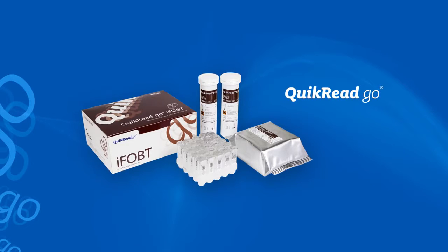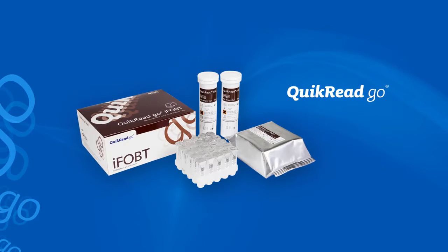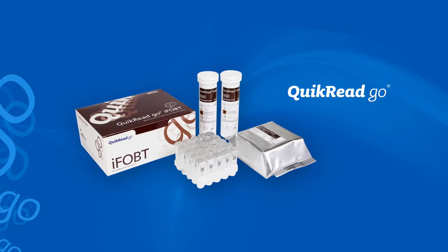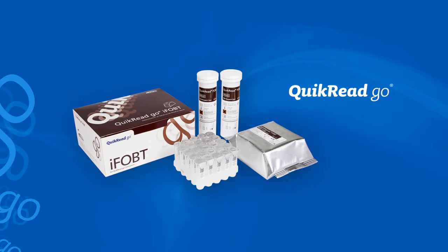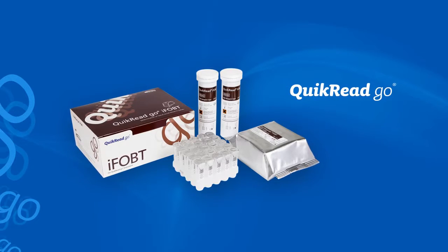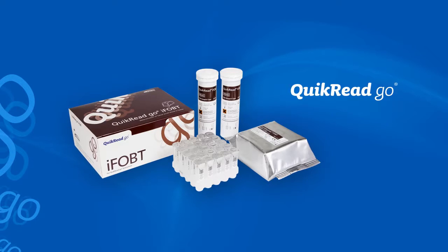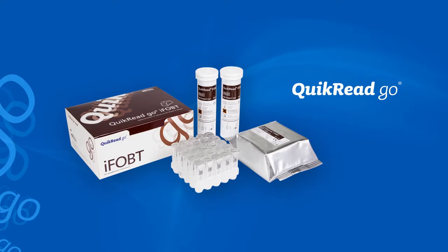Orion Diagnostica QuikRead Go iFOBT is an immunochemical test for detection of human haemoglobin in feces. The test is carried out using the QuikRead Go instrument and the result display can be customized to meet the user's need for either a qualitative or a quantitative result. The quantitative haemoglobin concentration can be displayed as nanograms per milliliter or micrograms per gram of feces, or both simultaneously.